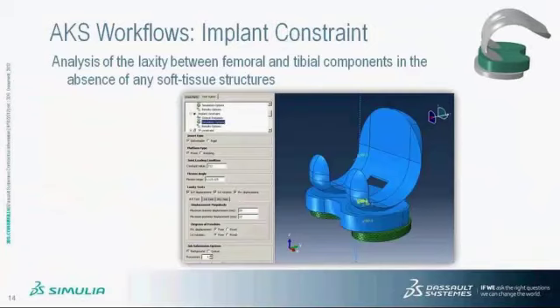The second workflow is the implant constraint workflow. This workflow is the analysis of laxity between the femoral and tibial components in the absence of any soft tissue structures. As compared to the previous workflow, one additional component that is included in the analysis is the tibial tray component. This is not required to be imported by the user. Instead, it's provided by the Abaqus knee simulator for output purposes.